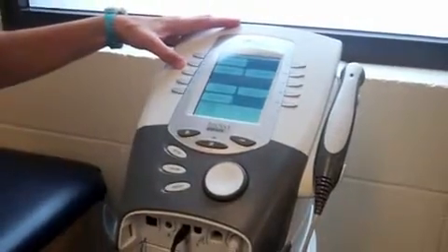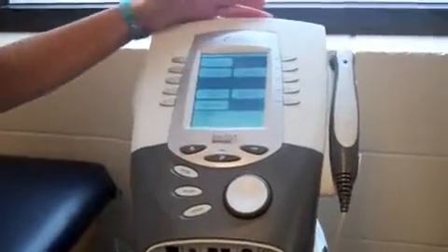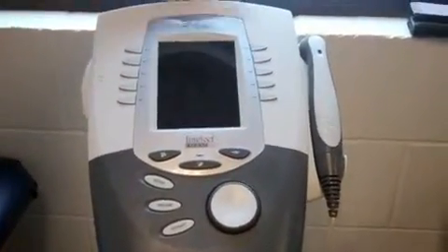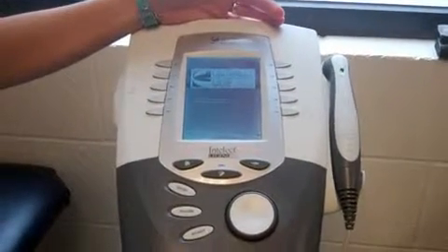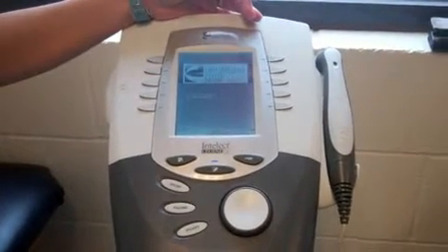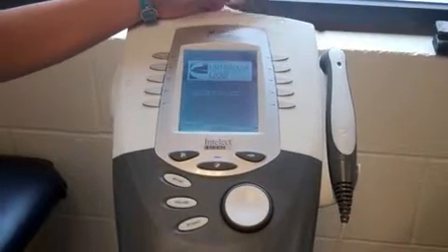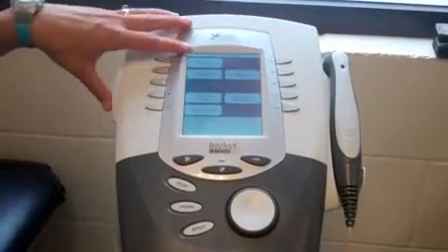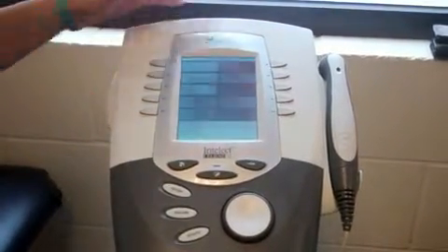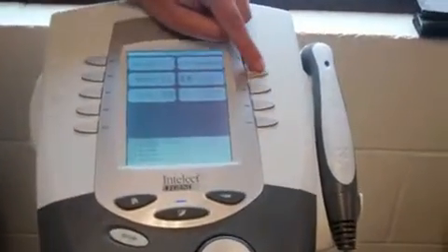We'll do muscle re-education using the Intellect machine. When we turn it on, this is the screen that comes up. This is under Electrotherapy, and for this one we're going to come over here to Russian.